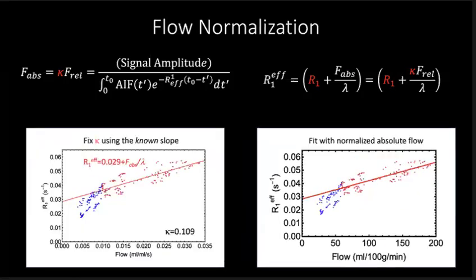And so doing that, we figure out what that normalization constant is. The normalization constant says the 3D amplitude is a lot bigger than the 2D single amplitude, and that's what you expect. 3D should be bigger than 2D. And here it is in terms of flow, in terms of milliliters per milliliter per second. So it's a pure rate.